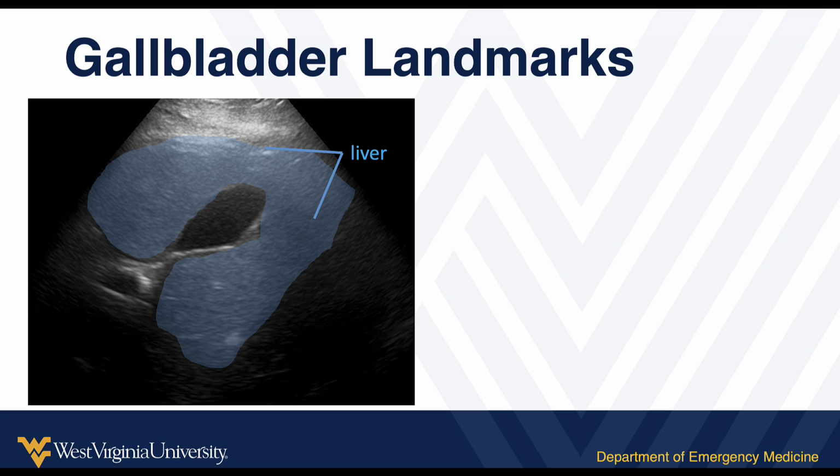the gallbladder, and part of this depends on the angle at which you obtain the image. And then you see the gallbladder. If it's normal, it's going to be a fluid-filled structure, and look for the portal vein, which you'll notice some little other tiny tubular structures around that. That's the bile duct and the hepatic artery running nearby.